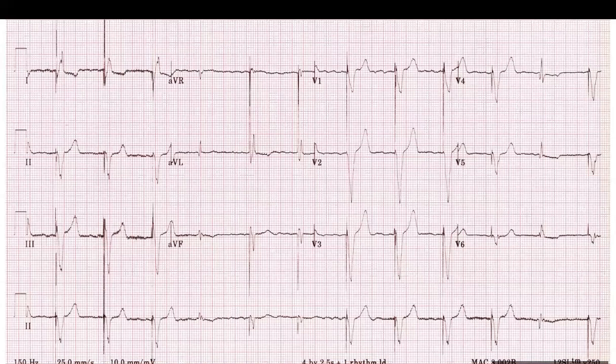The pacemaker function is to pace all the time. Okay. Then it gets an order based on the sensing that it does. Meaning, this is a ventricular pacemaker, so it's going to pace all the time. But in a VVI setting, the second V is the sensed one, and the third letter is what the device does in response to sensing. The sensed one is going to give orders to the first letter. Meaning, when you sense a V, you're going to inhibit pacing. So this is how the pacemaker is functioning. The first one is all the time, and it gets its order from the second letter, from the sensed one. So if you sense something, the device is telling you, okay, I'm going to inhibit pacing.